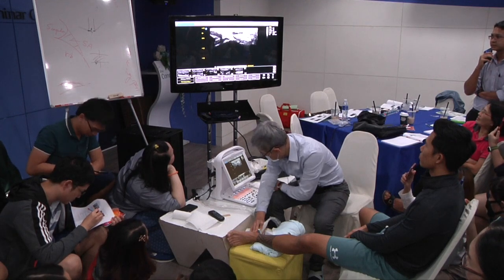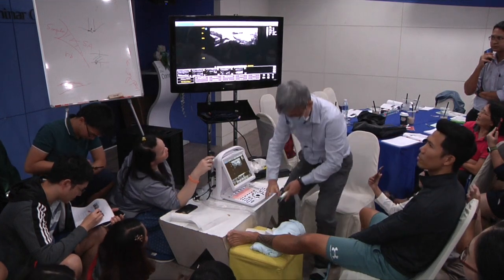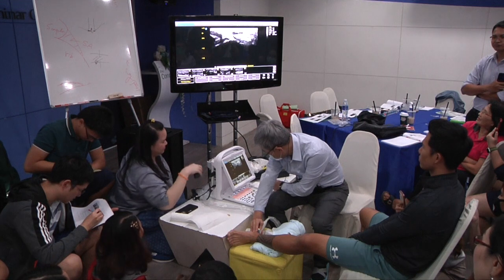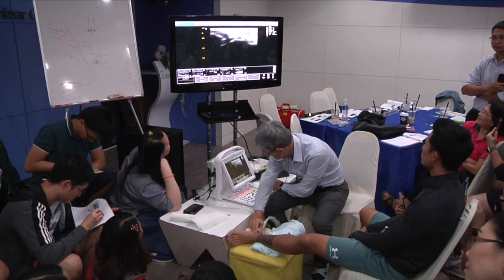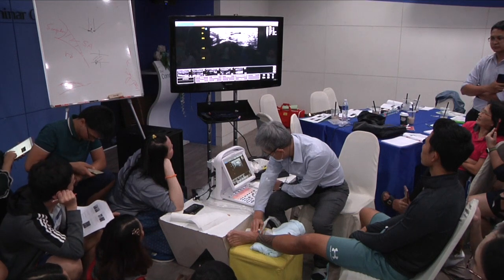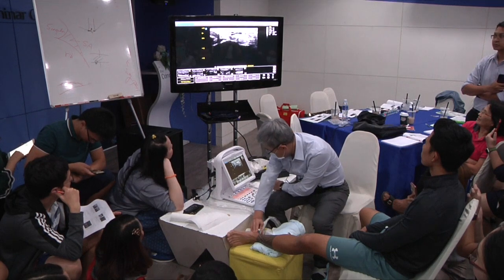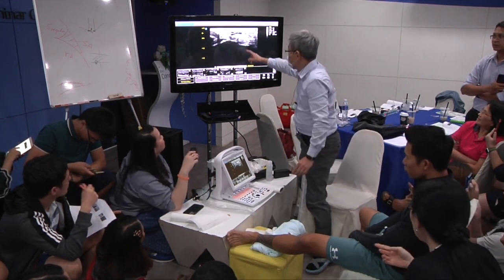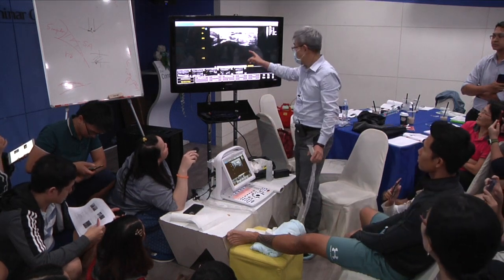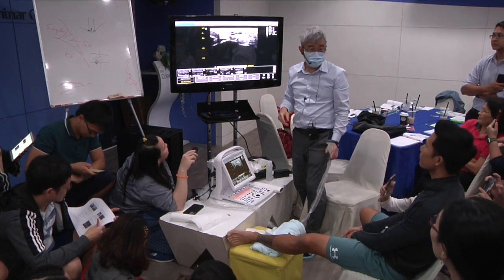Okay, thank you very much. Is it here, right? Do it again. More. More. Artery, nerve, flexor hallucis longus. Flexor hallucis tendons. Good? No problem, right?